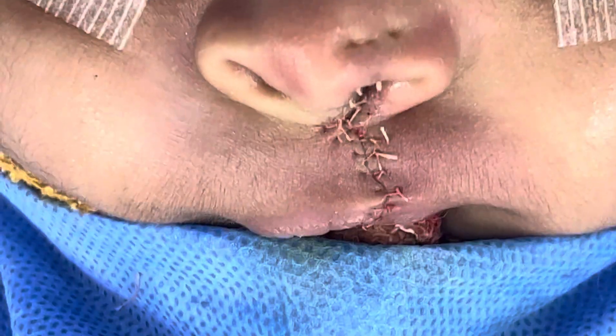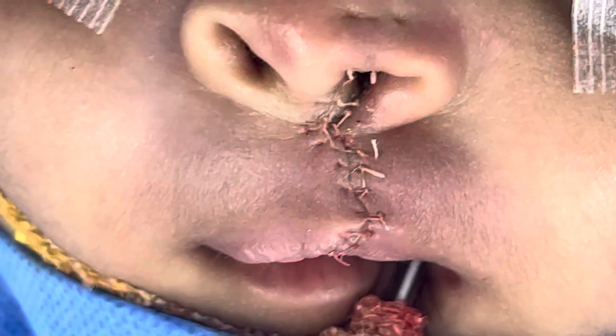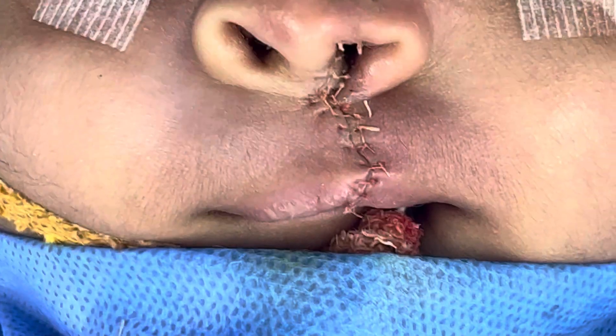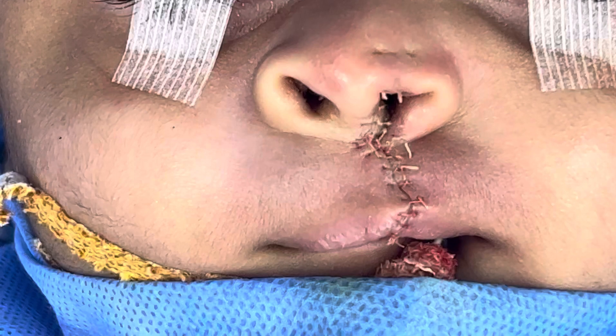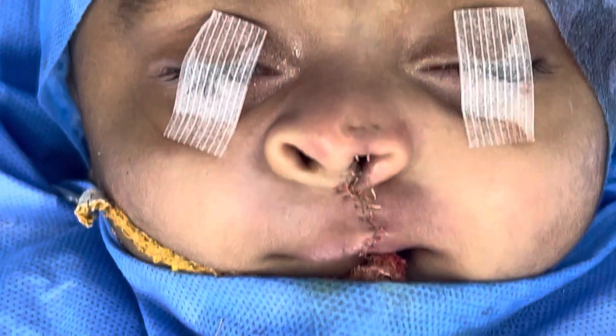We've completed this cleft lip repair. I'm going to show you the lip — you can see we've got a nice white roll match, we've got reasonably symmetrical nose, and I'm going to show you all of that.